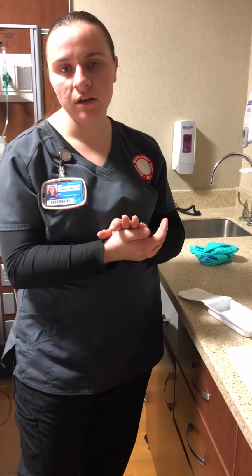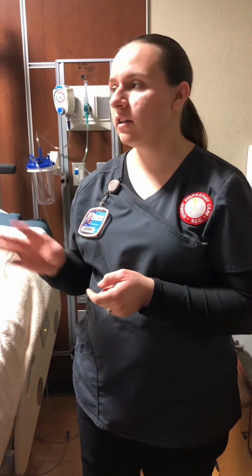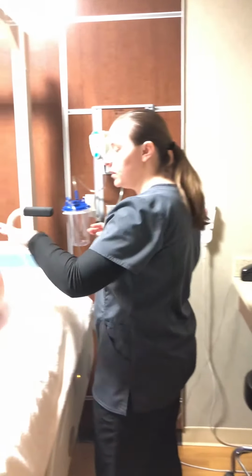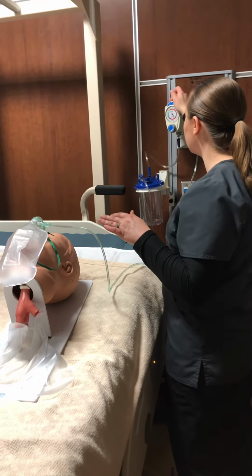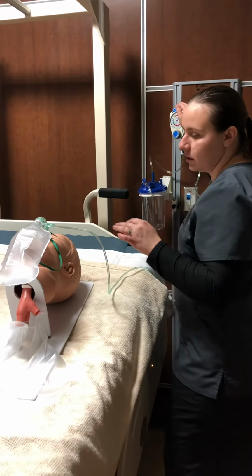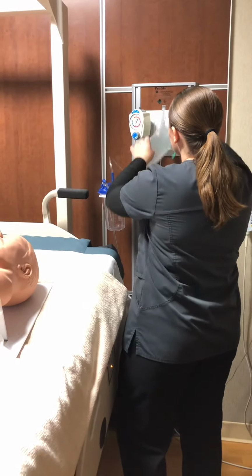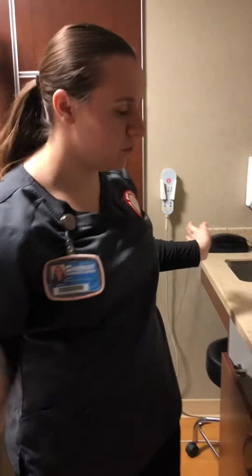Place another glove on. Then I would reassess the patient to make sure their lungs sound okay, see if the suctioning is helping. And then helping the patient, and then I'll check the vital signs to make sure that especially their oxygen level is okay. And if they are finished with the oxygen, I would shut it off. And then I always shut off the suctioning. And I would remove the mask and set it in the appropriate area. I'll set it there for now. Alright. And so then I would remove everything.